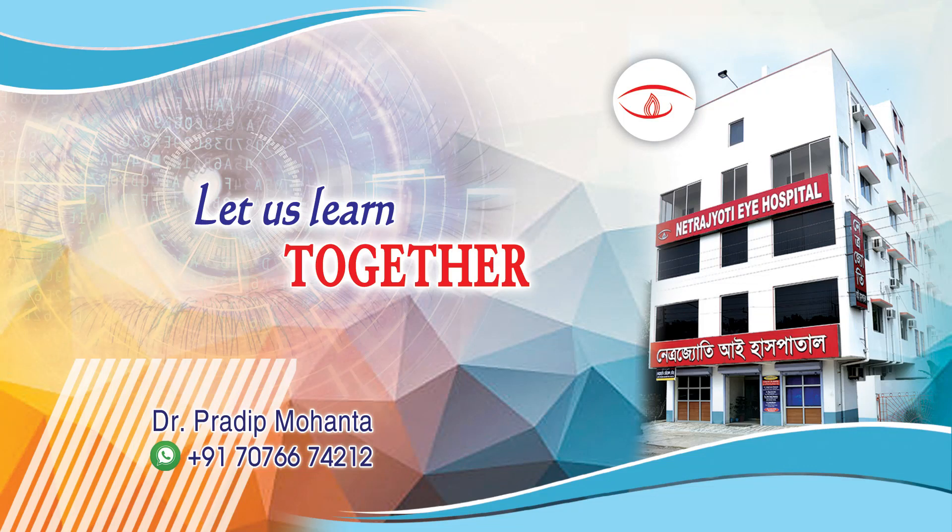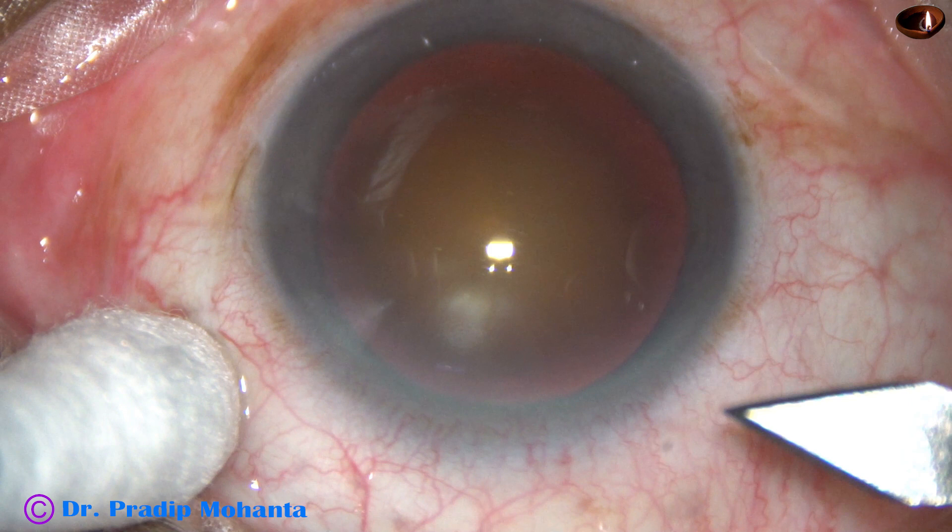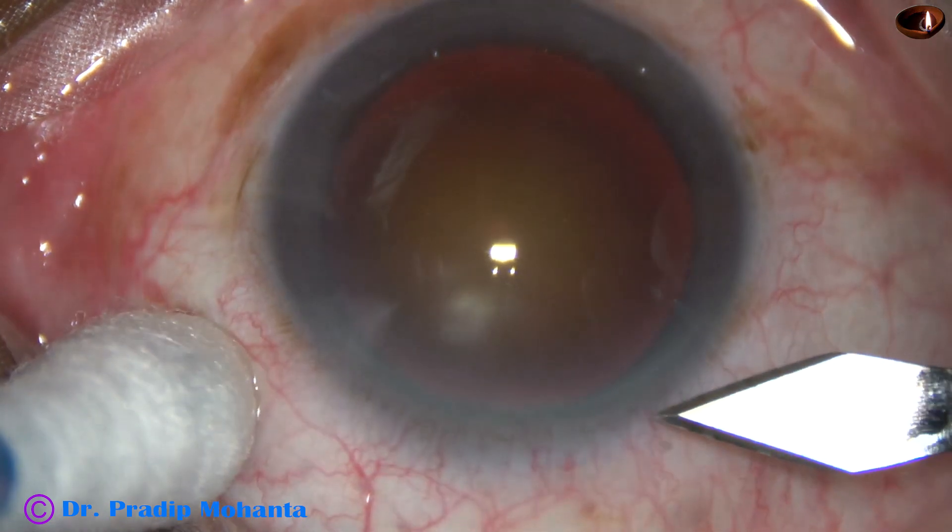Friends, welcome to my workplace at Ranaghat, West Bengal, India. This is a cataract with grade 4 nuclear sclerosis. Let us observe this surgery.